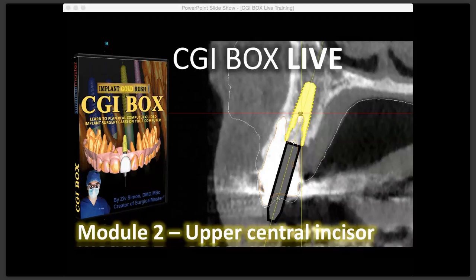So what I showed you in this training was a simple case. This was not a difficult case, but we talked about it for an hour and a half, because I focused on some important nuances that not everybody is aware of. Andy, thank you so much for the feedback. Even for the x-ray you showed, if you take one x-ray, you can go wrong if it's not a guided surgery. You can actually change the angulation by looking at just one x-ray. Exactly. If it was free-handed and the x-ray was wrong, we changed based on that. Basically, we're treating the x-ray to treat the patient.